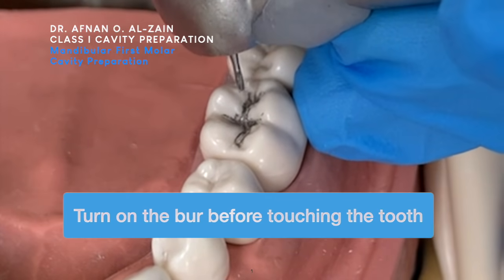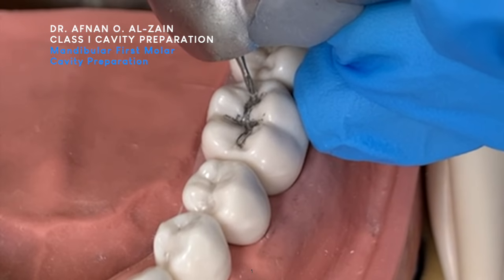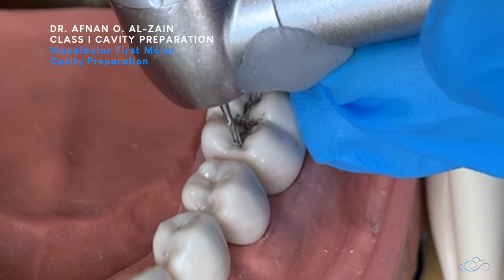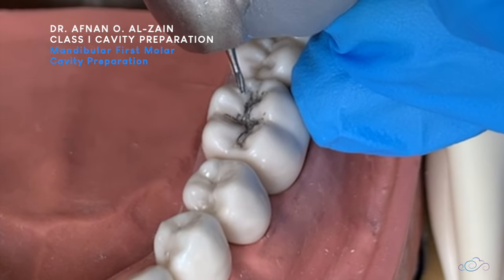We are going to turn on the bur before we start, and then we are going to do our depth cut. We move from one proximal triangular fossa until the other triangular fossa. After that, we move buccal, lingual, and then we enter the distal groove. Now we are going to start.